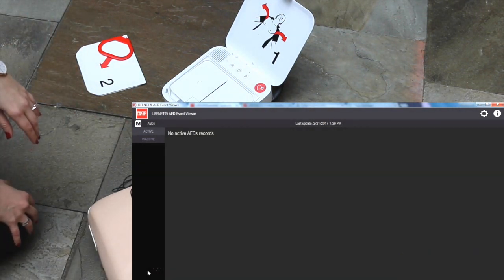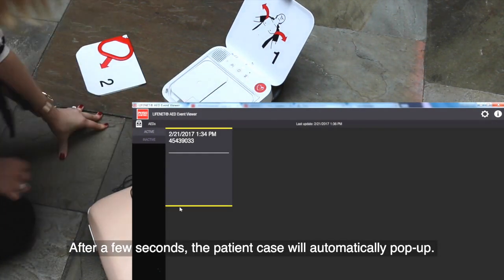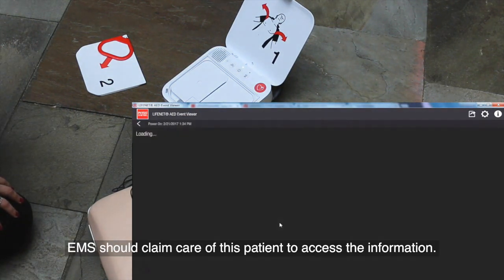Analyzing heart rhythm. Everyone clear. Press flashing button. Shock delivered. Provide chest compressions to the beat.